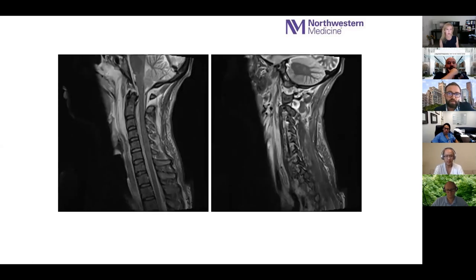And what do you see here, Wendy? Yeah, so again, the first thing we notice is that extensive prevertebral edema, which we saw even on the x-rays. We knew something was wrong there, but it looks like all of your ligaments are disrupted up here. Exactly. Apical and your atlanto-occipital membrane, everything. Posteriorly, it's hard to tell, but at least all the interspinous ligaments are. Exactly. And marked widening there of C0-C1, like we saw before. So all the ligaments are disrupted: the capsular ligaments, apical ligaments, alar ligaments, tectorial membrane, everything.